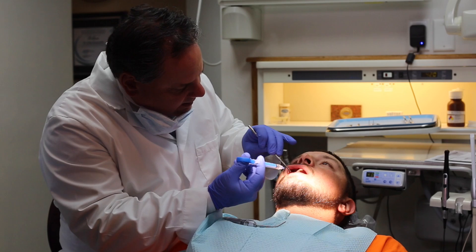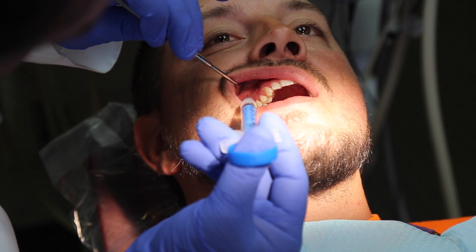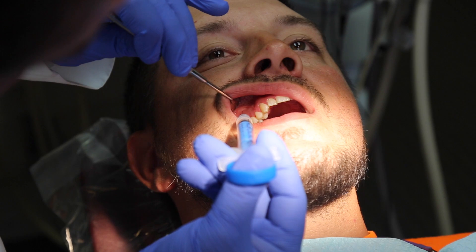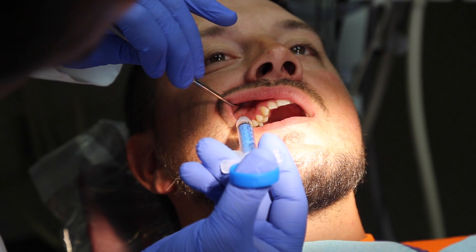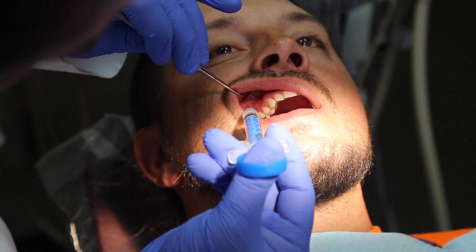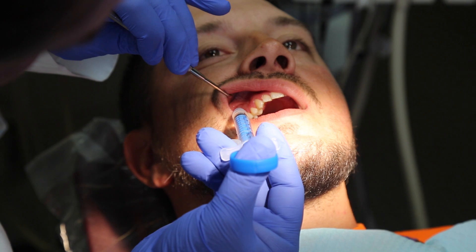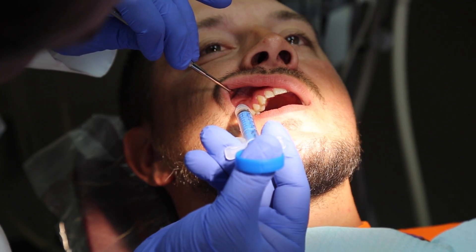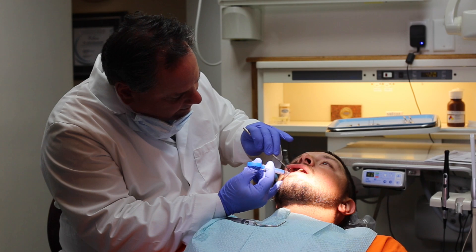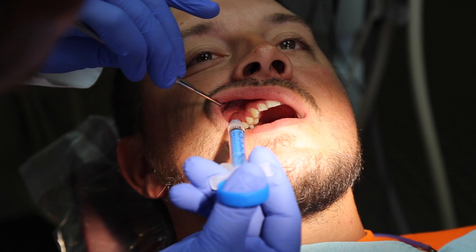Just letting it soak, and now we'll put a little bit of medicine in. I like to use a very light drip-drip process — I'm actually thinking about that speed as I'm doing it. The beauty of this system is that as we do it nice and slow, the patient has very little to no discomfort. I advance the needle as each drip goes in a little bit — I usually take about a minute to a minute and a half. Another nice thing is that the volume of material is much less; I'll probably only use a half ml here.